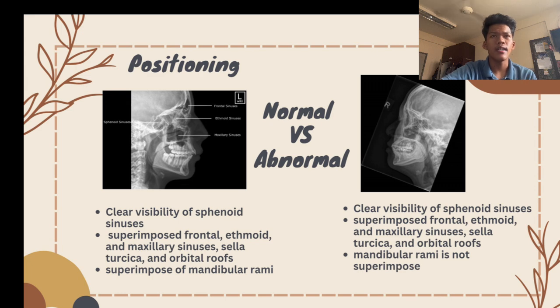And lastly, there is superimposition of the mandibular rami, which means there is no tilting left or right of the head.